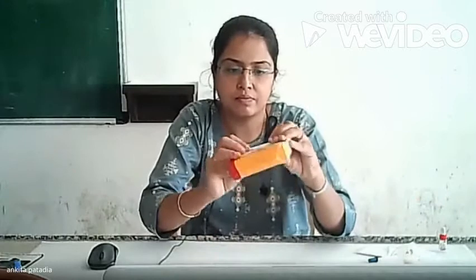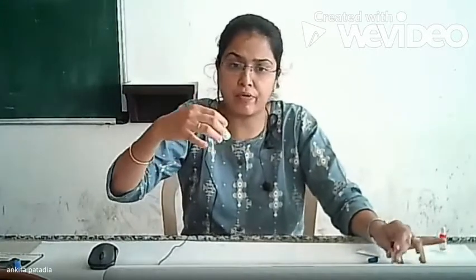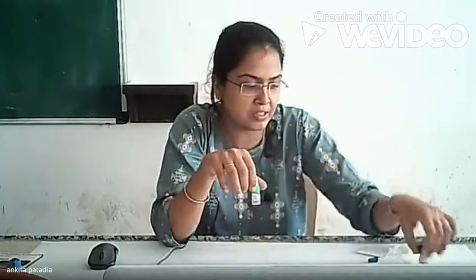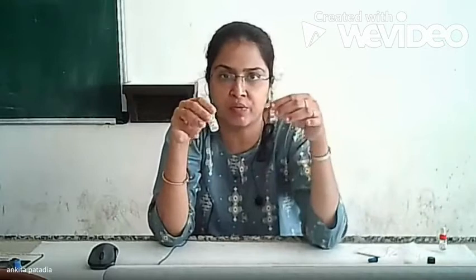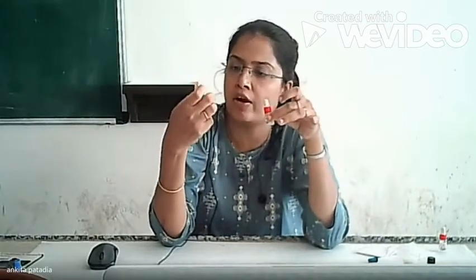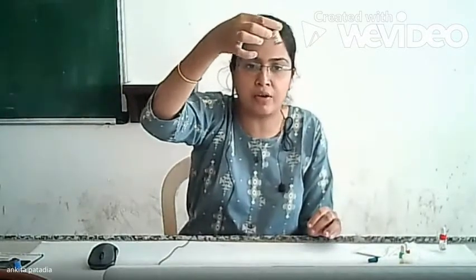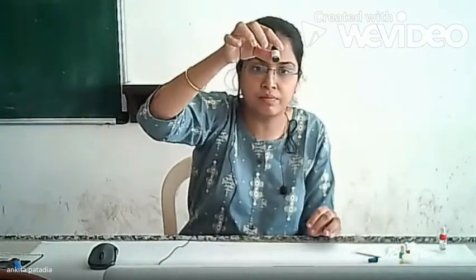Right. Now in the market, kit is available like this. RPR kit having this type of negative control. This is the negative control. This is the positive control. Green colored is a negative control already written. Red color is positive control, and this is the carbon coated antigen RPR, black colored. You can see that at the bottom.